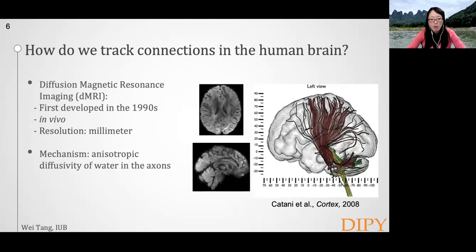Here is briefly how it works. The diffusion-weighted signal reflects the direction of water diffusion in the brain. In the axons, water diffuses most easily along the long axis, thus generates strongly anisotropic diffusion signal. Based on this signal, one can model the most plausible orientation of axons in different locations of the brain, and put these pieces together, one can infer the trajectories of axons.